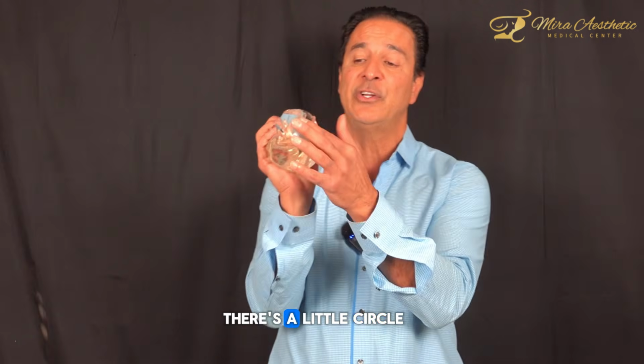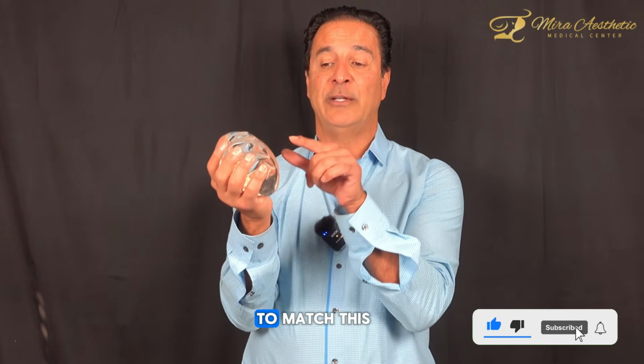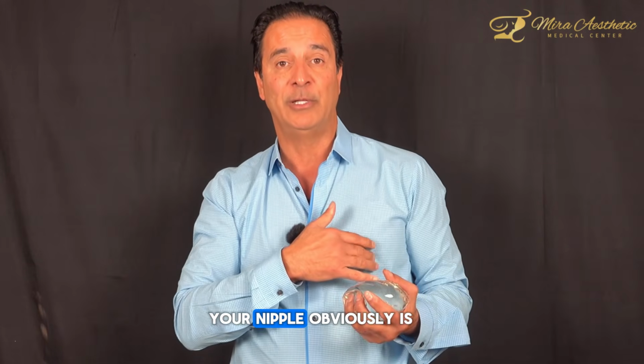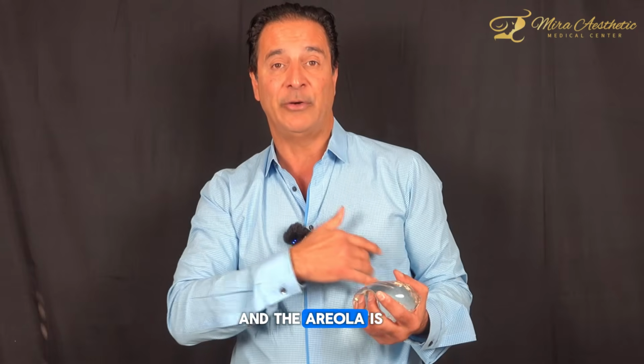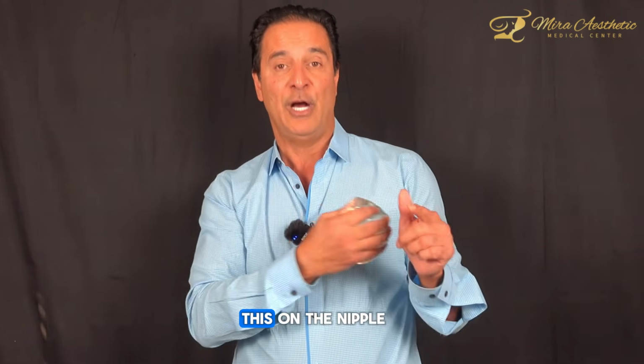As you can see, there's a little circle on the implant. Most doctors try to match this with the center of the nipple areolar complex. The nipple is the nipple, and the areola is the brown part around the nipple. You want to put this on the nipple.